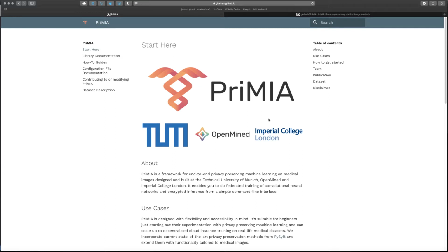I'm the project lead for PriMIA, and in this unstructured, unscripted screencast, I'd like to give you an overview of the library, do a little bit of a walkthrough through the code, and show you how to do a couple of things with PriMIA. So let's first of all talk about what PriMIA is.